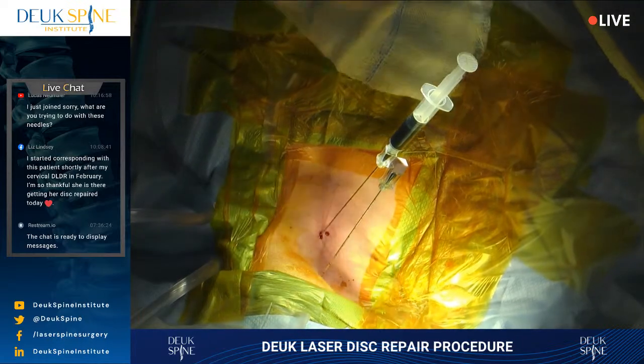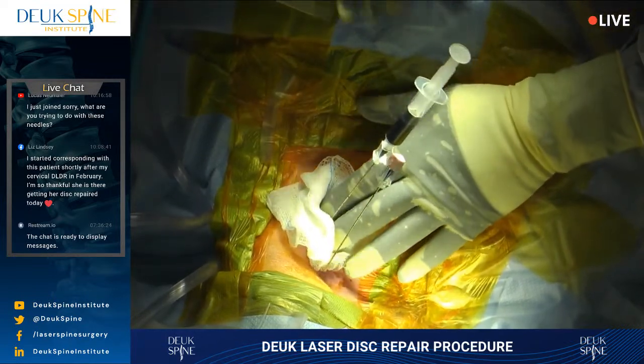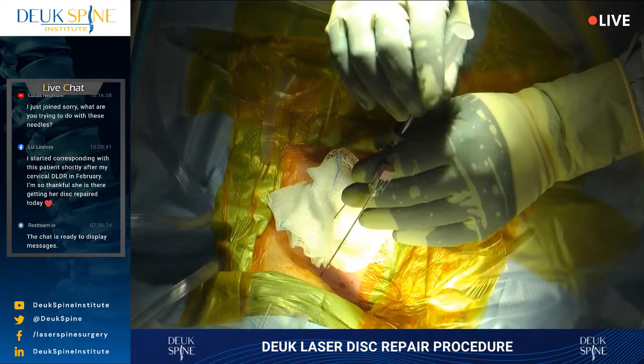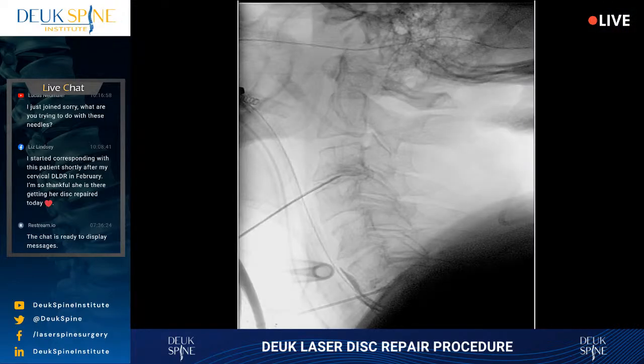So we've done the discogram, and disco is for the disc, the spinal disc. Gram is basically an imaging technique where we're using an x-ray, which is this fluoro machine here, and we're entering a dye into the disc and looking at where it's leaking out. And you can see it's leaking out in the front and back. The front leak out I'm not concerned about. It's not causing any problems for him. It's the one in the back where the tear is. That's where the pain comes from.